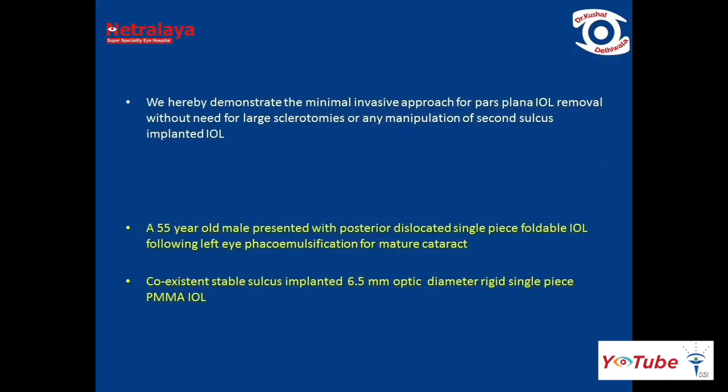We hereby demonstrate a minimally invasive approach for pars plana IOL removal without the need for large sclerotomies or any manipulation of the second implanted IOL.